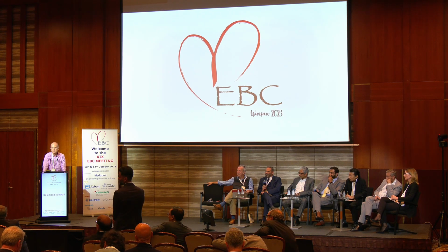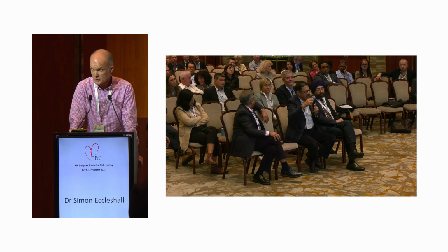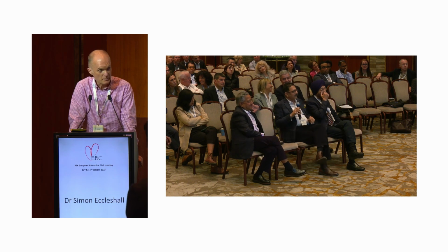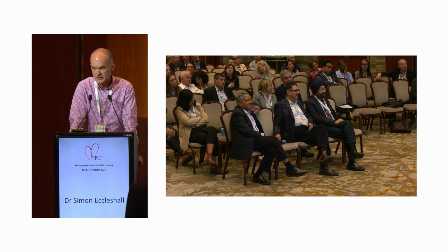The dissection here appeared to be a spiral dissection, which, if you follow the basics, these spiral dissections get worse, number one. Secondly, your injection makes the dissection worse. So just use very low pressure. I'm sure there are people in the room a bit like us that have done an awful lot of DCB angioplasty, and you don't make iatrogenic dissections from balloon angioplasty worse with injections, except those that are already vessel-threatening dissections that you need to stent, and those you just need to get on and stent.